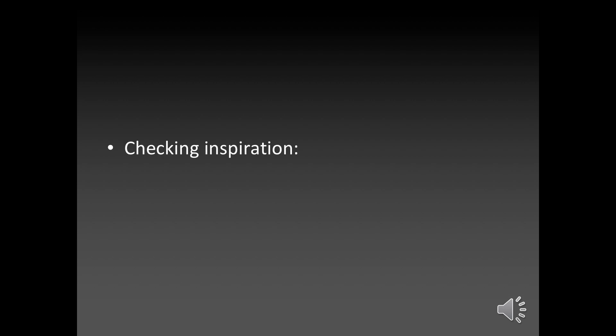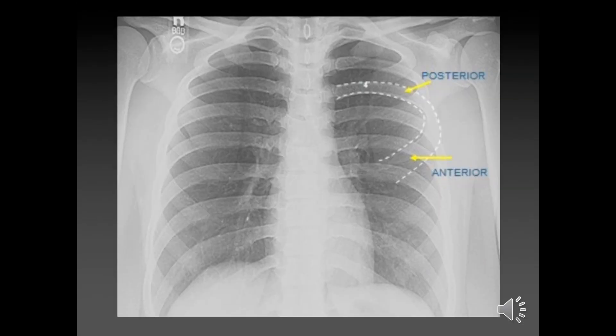Inspiration is the third aspect to assess. When looking at inspiration, we look at anterior or posterior ribs. You count from the top to the rib that is intersecting the diaphragm at the mid-clavicular line. This is the mid-clavicular line here, and this is the diaphragm — so this is where you're counting to.